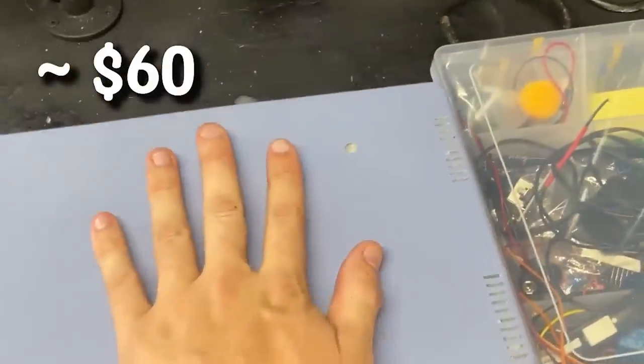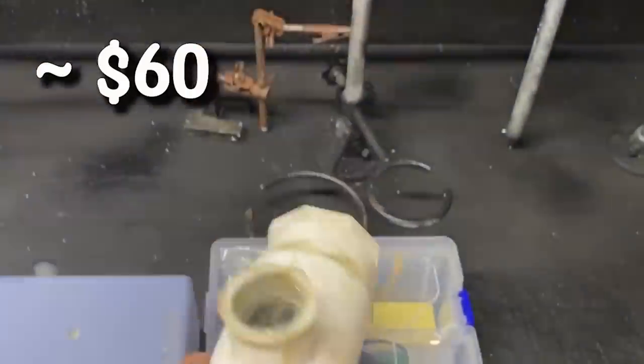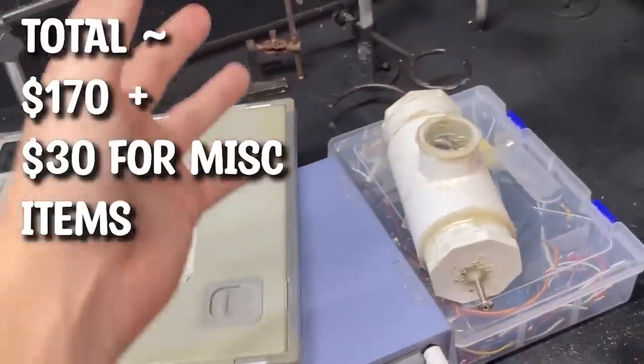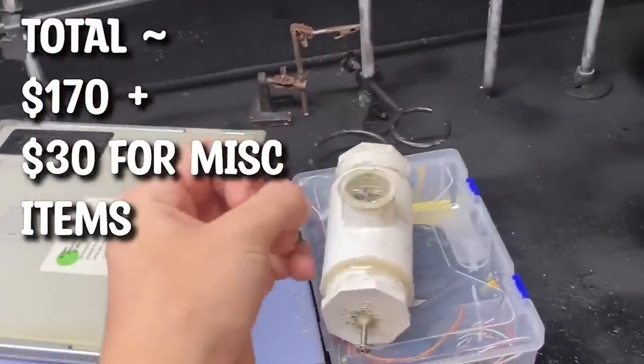The good news is I've got about $200 in my wallet and that's all we're going to need to build our own DIY CAT scanner. The components we need are: an Arduino kit, a high voltage DC power supply, an x-ray tube from a mammogram machine, and an x-ray intensifying screen. That's practically all the stuff we need to make a fully functioning CT machine.